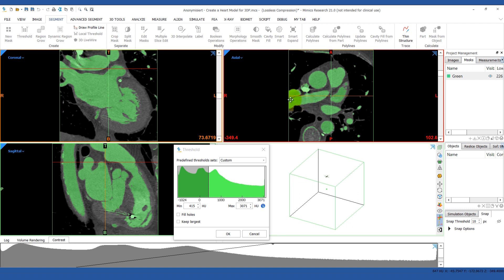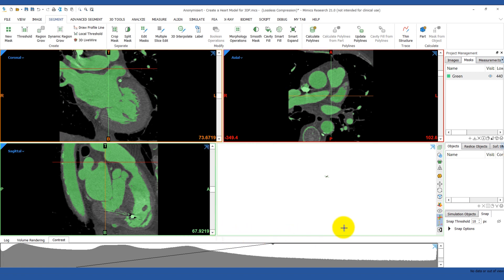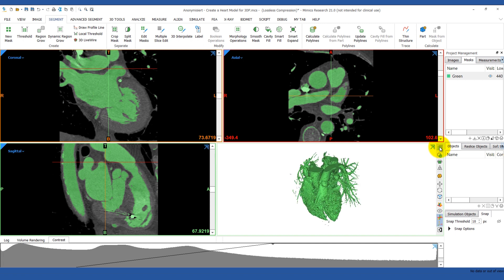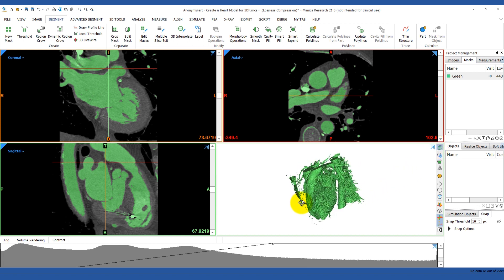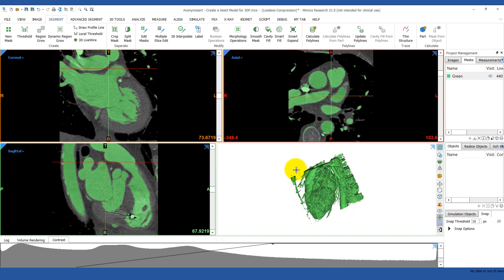You can see that there are some areas where the pulmonary vein and pulmonary artery are bleeding into one another. If we try to break this connection by increasing the minimum value, we'll lose too much of the other blood pool. Sometimes we may have to accept a few false connections and then manually touch them up. If we turn on the 3D preview, you can see that the spine and part of the sternum are also included, so we're going to use the Region Growing tool to remove these.